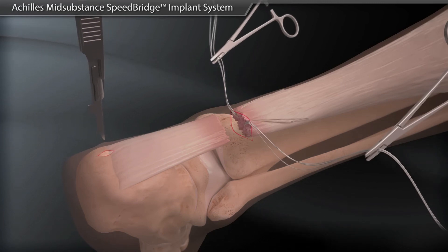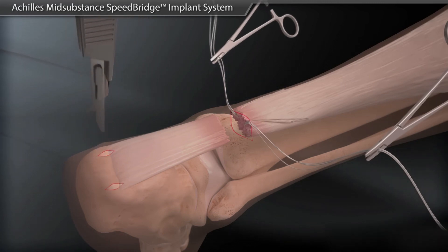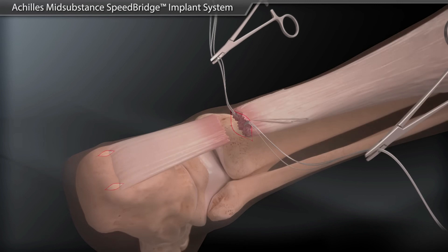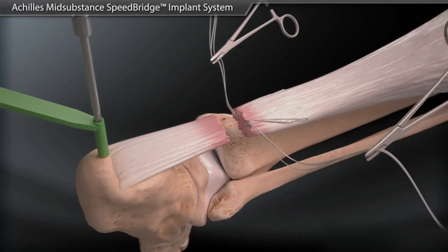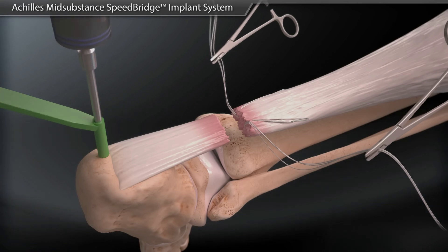Two stab incisions are made directly down to bone over the insertion of the Achilles tendon. The two stab incisions are drilled and tapped in preparation for later swivel lock insertion.